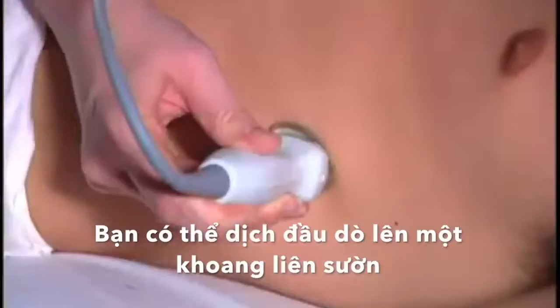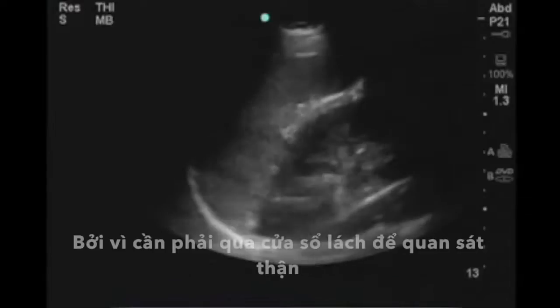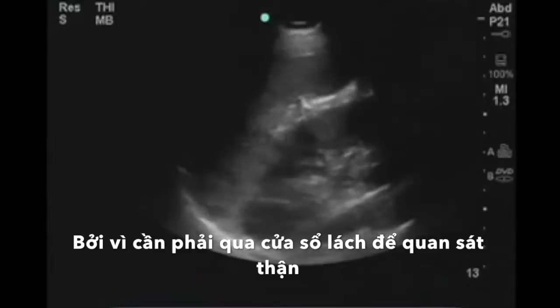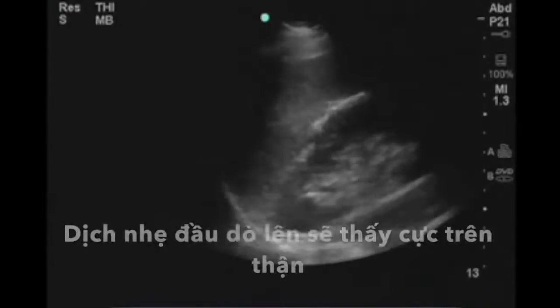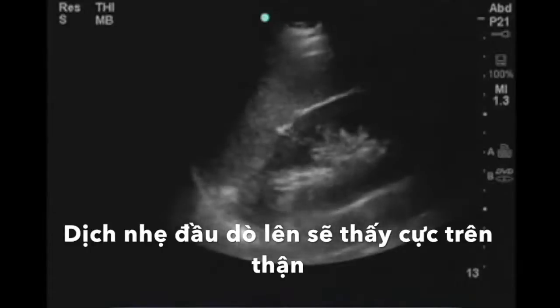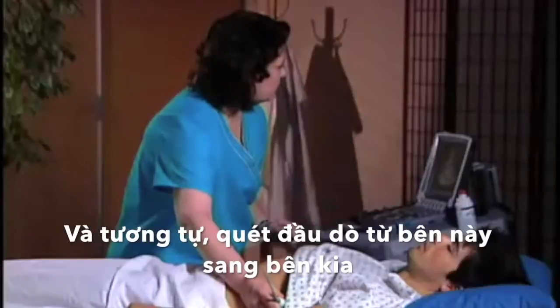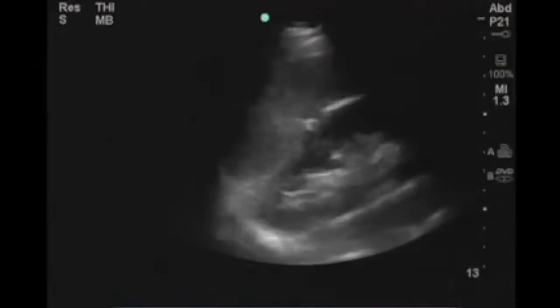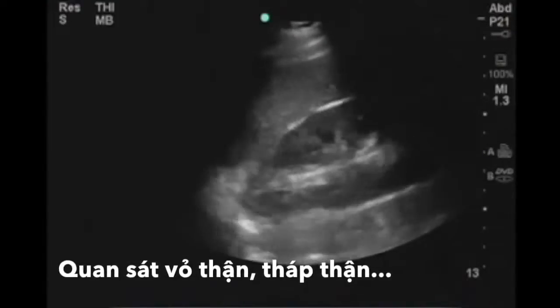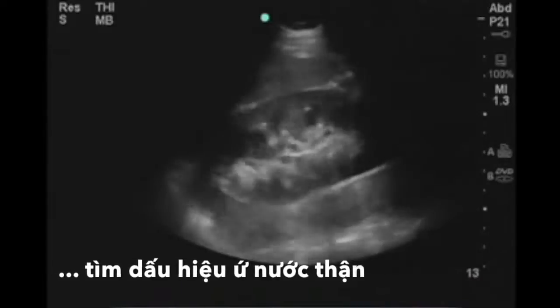You may need to move up a rib space or two to determine how high and how small the spleen is, because you're using the spleen as your window to evaluate the kidney. If I move up a little bit, I can see the superior part of the kidney on this ultrasound image, and I'll just sweep from side to side, again looking at the cortex of the kidney, the renal pyramids, and also trying to determine if there is hydronephrosis present.